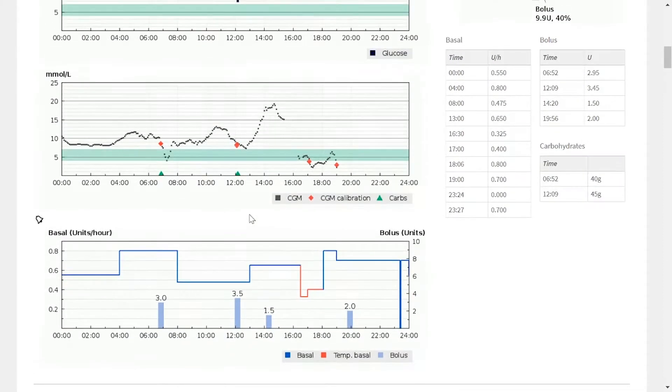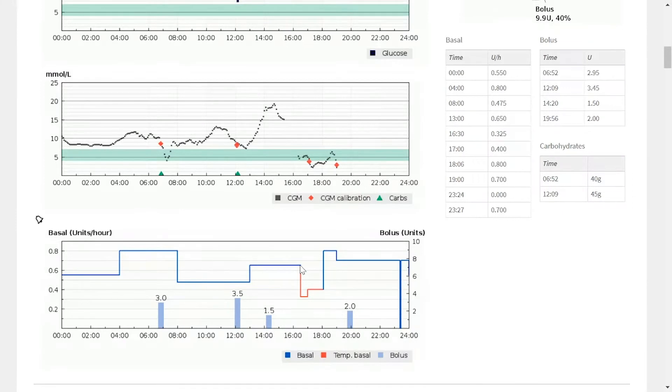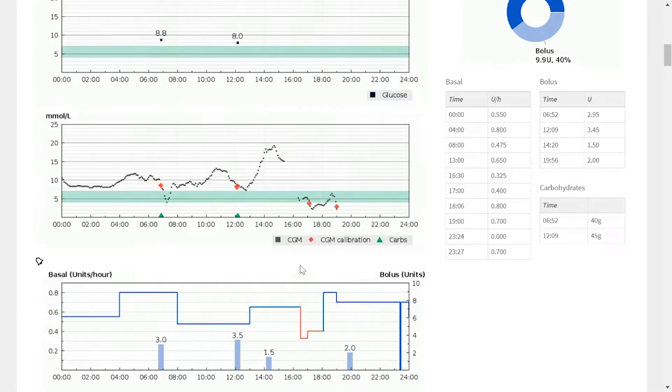You will also see, looking at the basal profile, that we have a temporary basal that a patient has used at this point. So that could be a conversation in itself, or even looking at if a patient is calibrating their CGM.